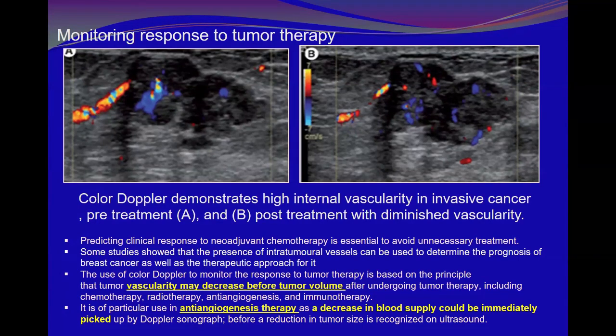Especially, it gives us an impression of functional effect, because the size of the lesions might not be affected in early conditions or early after treatment. The size, because of the effect of treatment, might result in necrosis and fibrosis, and this not only hinders the regression of the lesion size, but might give the apparent impression that the lesion is getting larger.